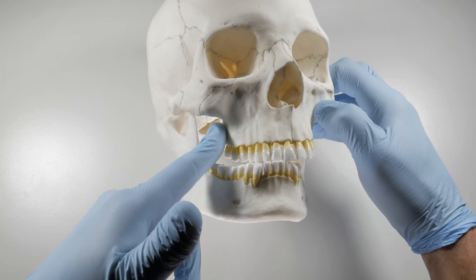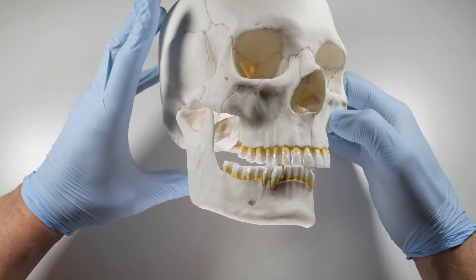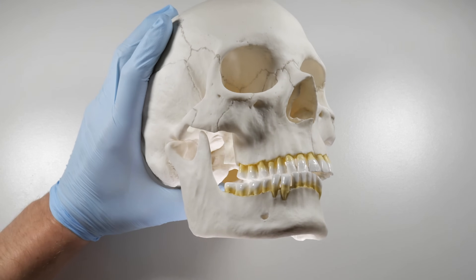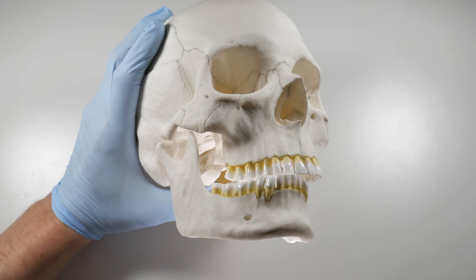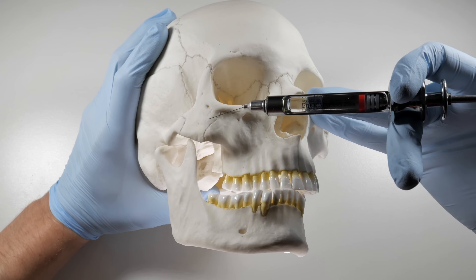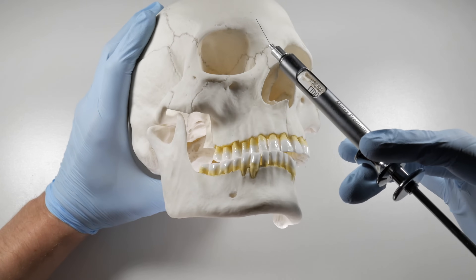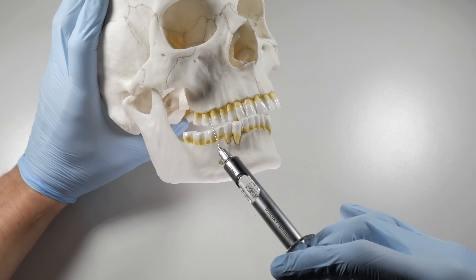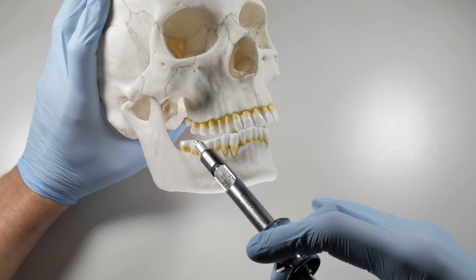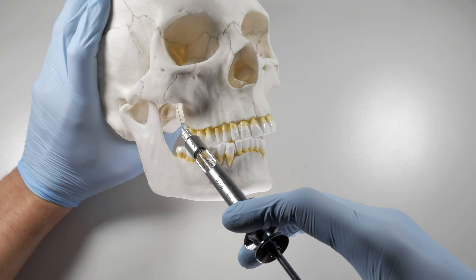So you've applied your topical and located your insertion position. We are now going to look at inserting our 27 gauge short needle. What I will often do — and you can maybe see it here — is I bend that needle a little bit so that I can get a little bit more medial in this injection. It just helps so you don't have to swing out quite as much, and you can come in at a slightly shallower angle.